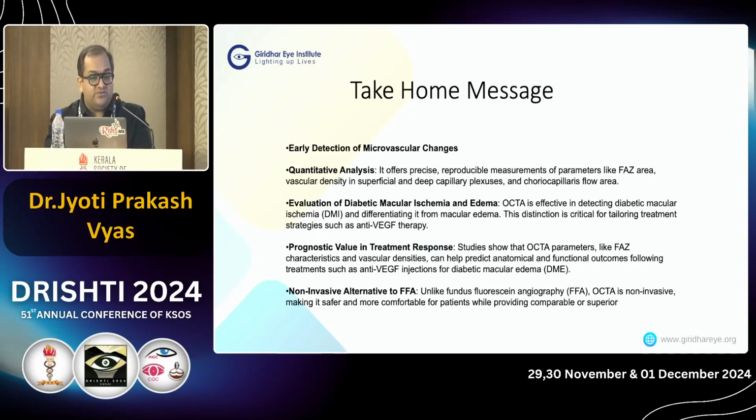So the take home message would be, although OCTA has all these benefits, it has to be taken with a pinch of salt. It is yet about time that we mature onto this investigation, but we need to update ourselves regularly to use it across different indications and for interpreting it reliably.